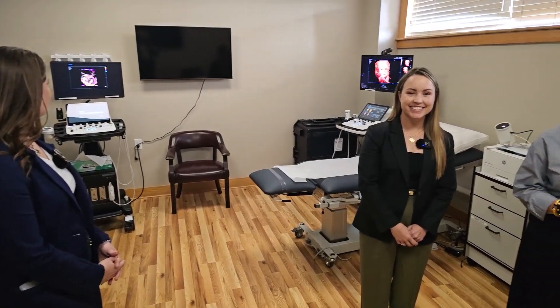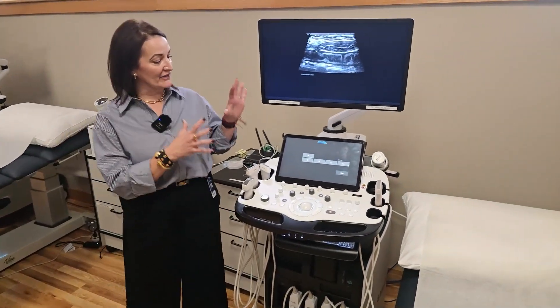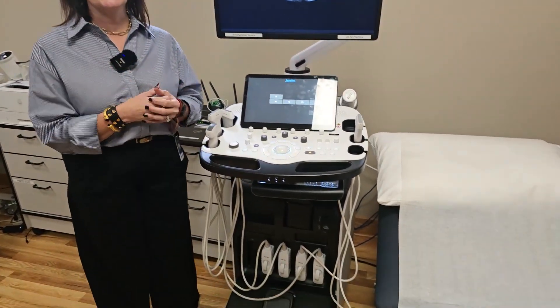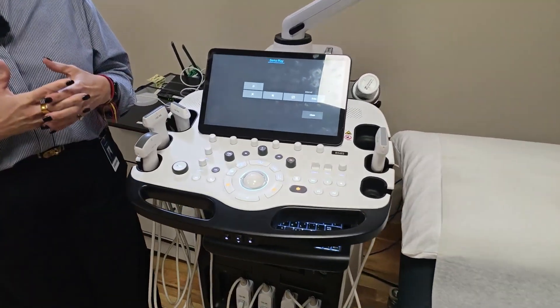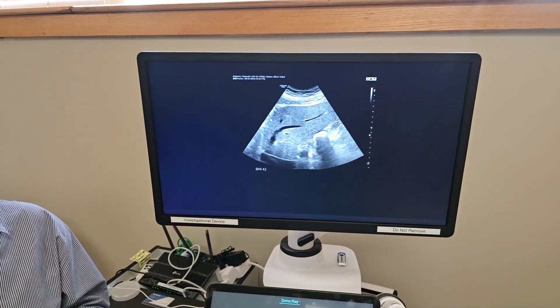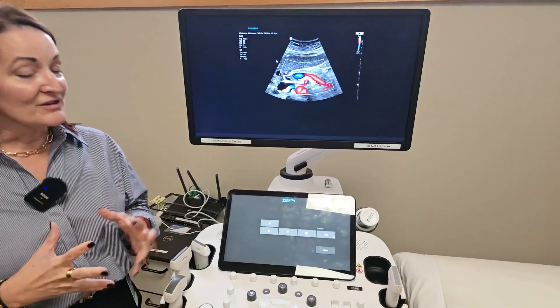Yeah, there are many cool things going on — different types of studies, all simulated at this point. So this is our radiology flagship product, the RS-85 Prestige. This is the mecca of our ultrasound technologies. It has amazing radiology image quality for abdominal imaging, small parts, vascular, women's health, and 3D. It pretty much does a little bit of everything really well.